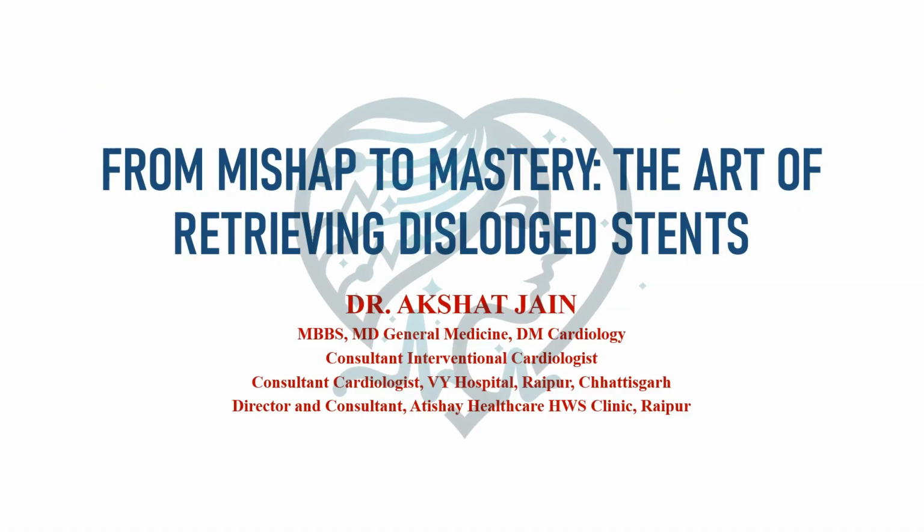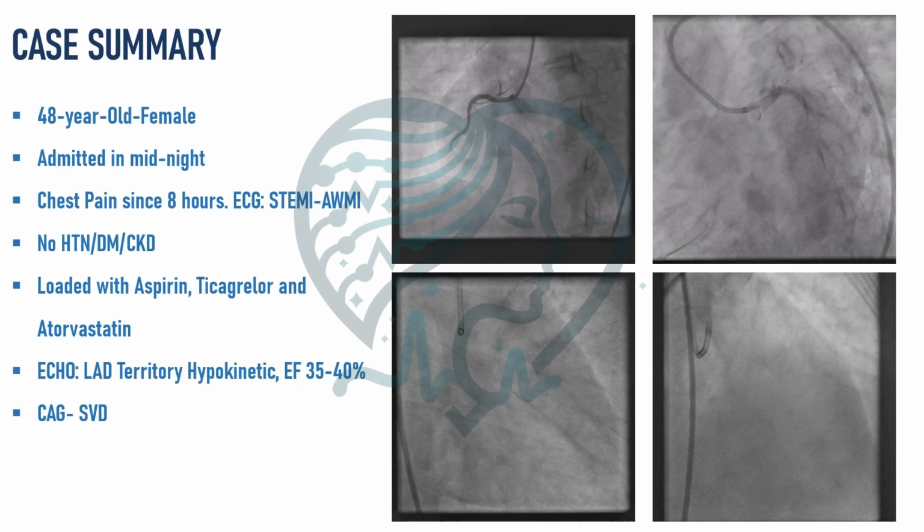Hello everyone, myself Dr. Akshat Jain, and today we'll be seeing this video which is based on managing a complication, that is stent dislodgement. So, from mishap to mastery: the art of retrieving dislodged stents. So this was the case summary.